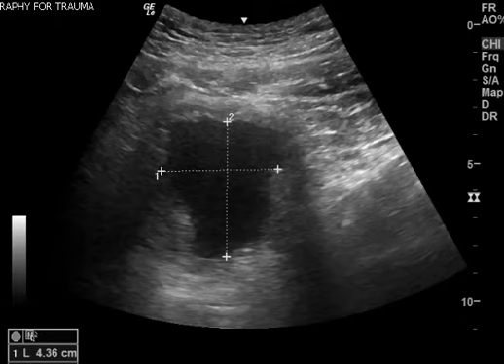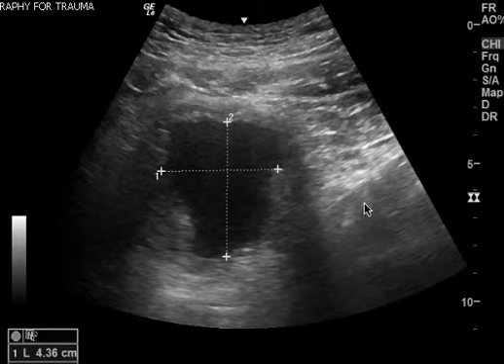This is a bladder volume calculation that was done, and this part is perfect. You have your height and length.